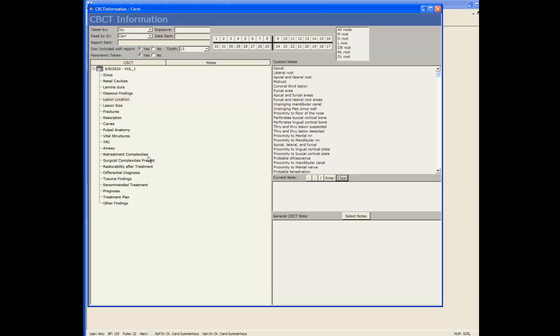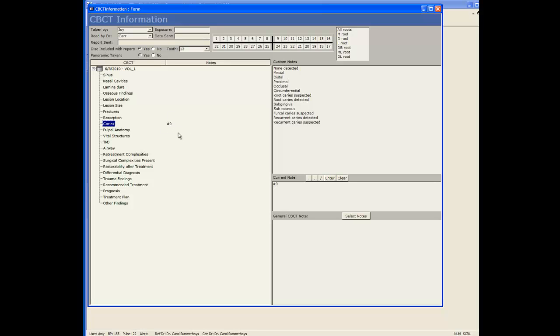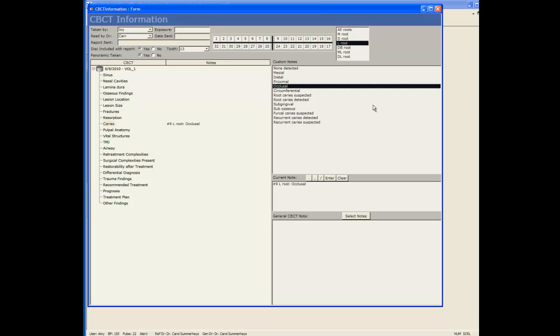I want to enter a carries note. I select carries on the left, select a tooth number at the top and this will add the tooth number to my current note. I can select a root if I wish to and then these custom notes here are common items that you would enter as a note for that individual item.